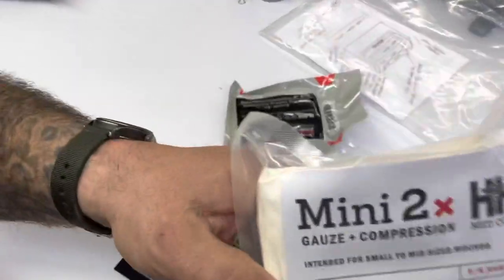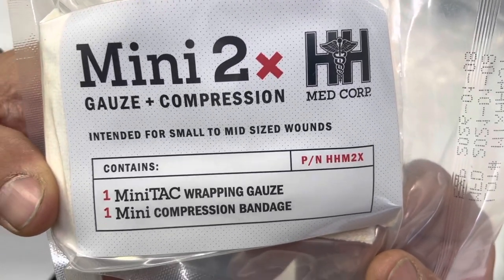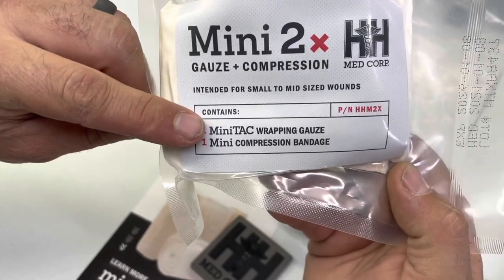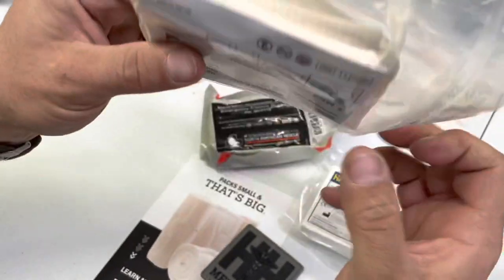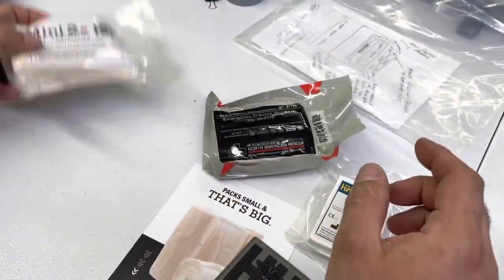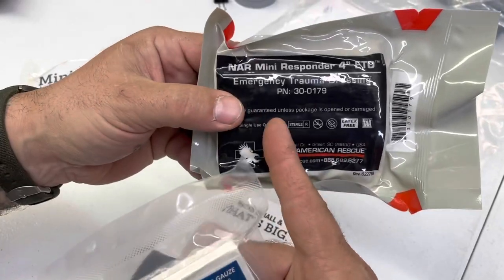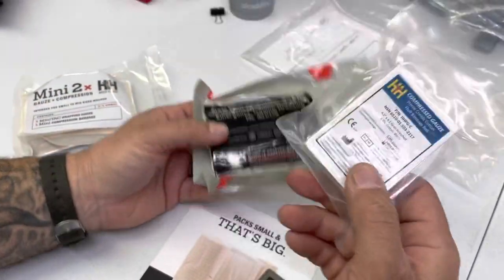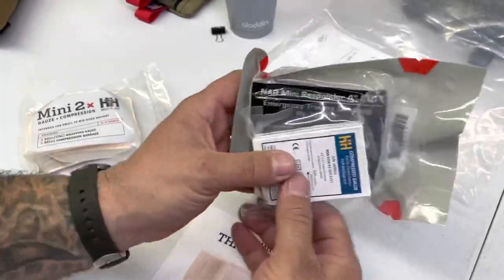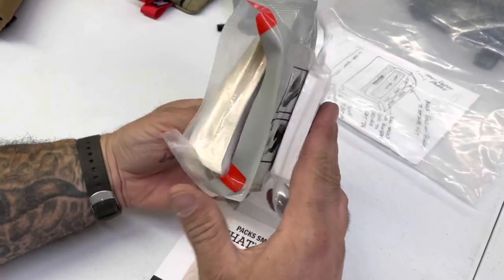This is the H&H Mini 2x gauze compression, intended for small to mid-sized wounds. It comes with one mini tack wrapping gauze and one mini compression bandage. It retails for about $10. This is the North American Rescue Mini Responder four-inch emergency trauma dressing, which retails for about $4, plus compressed gauze for about $2 - about $6 total. Size-wise, they're comparable.